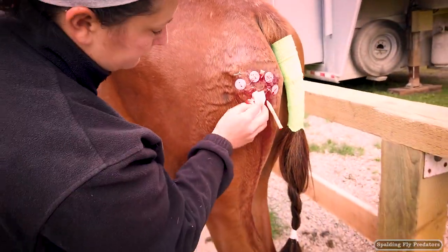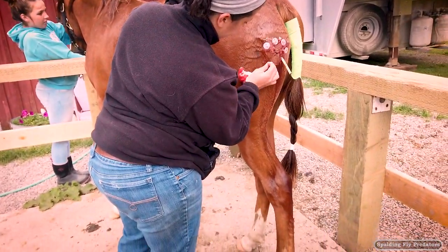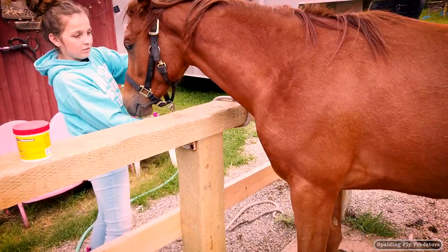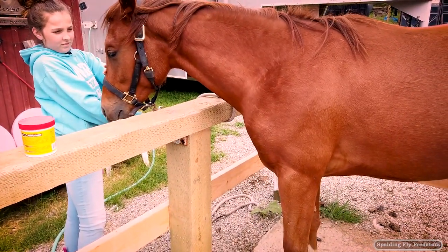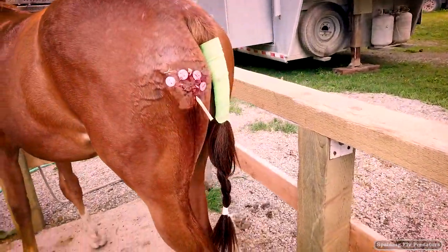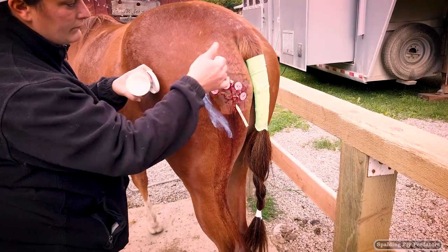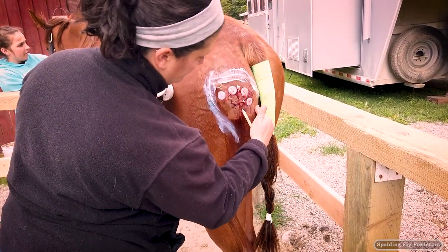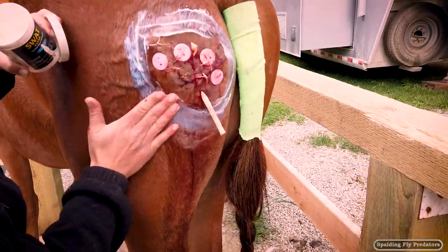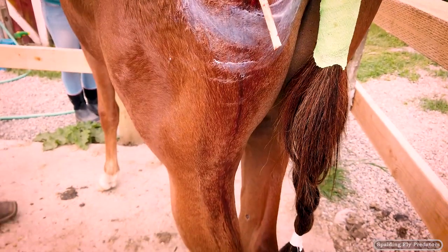Carolyn's getting him all cleaned up. He's going to be on antibiotics for a little while and then hopefully he should heal up just fine. There wasn't too much damage to that leg — just a little bit of muscle nick. Most of it was just skin. This little yearling Arabian took a lot of drugs to get him quiet enough to do this. He was pretty wiggly, which is why we couldn't video the whole thing. He'll have a booster for his tetanus and should recover just fine. Carolyn's going to put some SWAT around the edge of that wound to keep the flies off — we don't put it over the sutures themselves. Down at the bottom of his leg you can see where it's drained down, and she's going to put some ointment there to keep the drainage from scalding the hair off his leg.